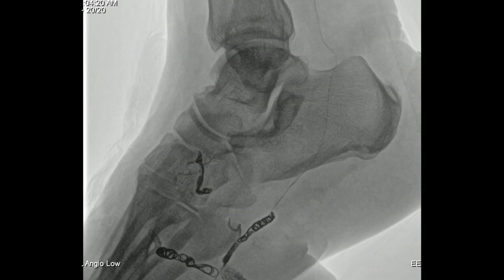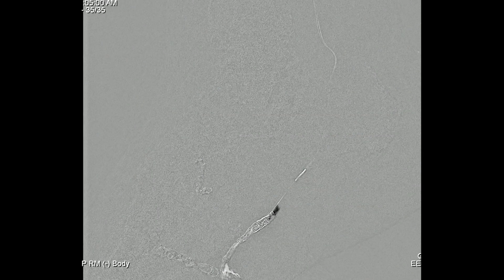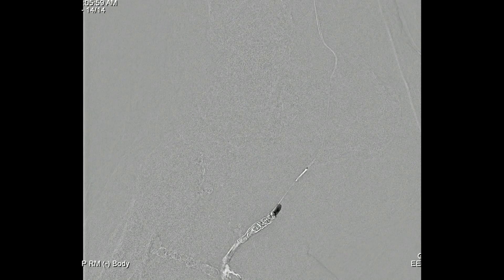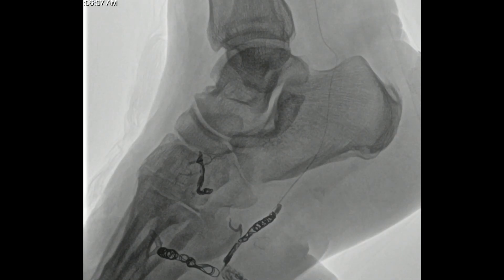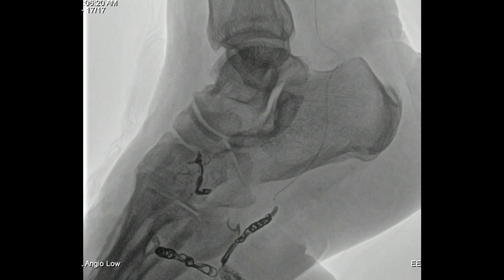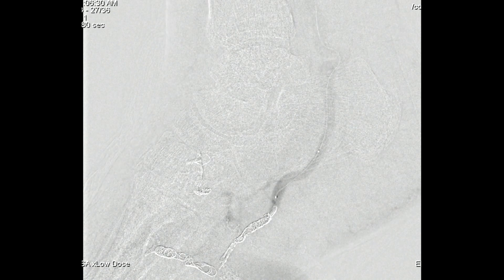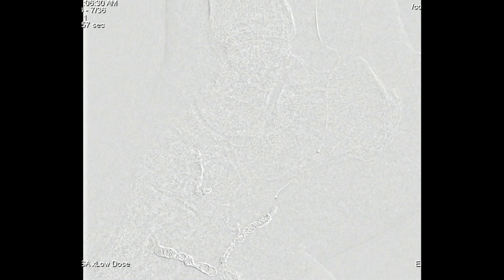One challenge we had is that because we're so far down the leg, we had intermittent problems using the QuickCross catheter along with the directional microcatheter. We actually had to cut the QuickCross so that the directional catheter would protrude out of the end of it. The QuickCross has three radiopaque markers so you know where to cut by looking at them. You can see onyx going into the distal posterior tibial — probably at the malleolar artery level — and now it's completely occluded.